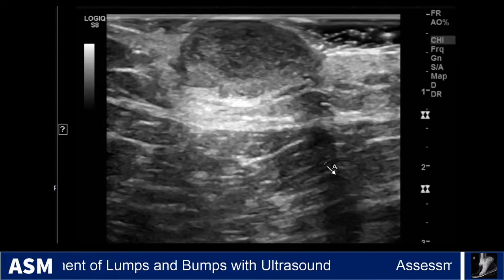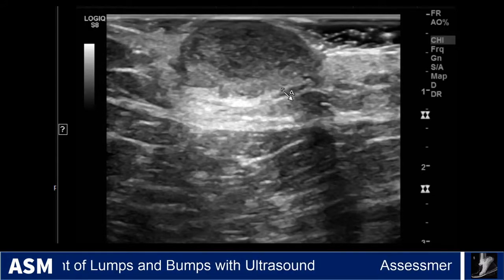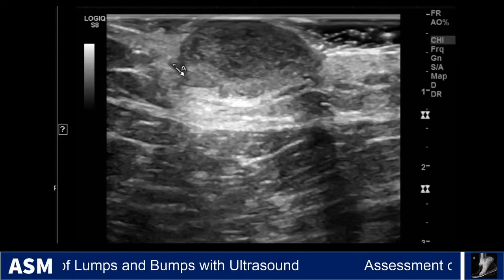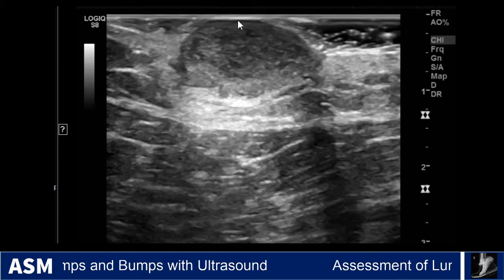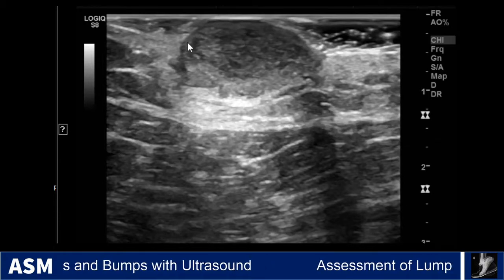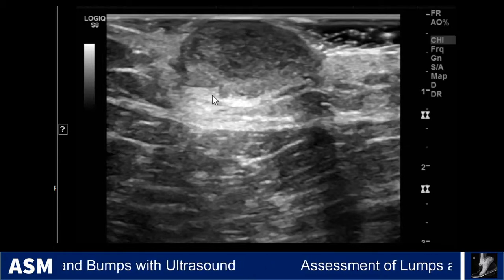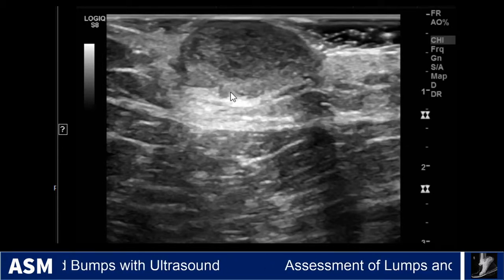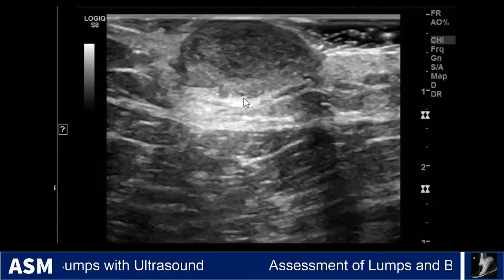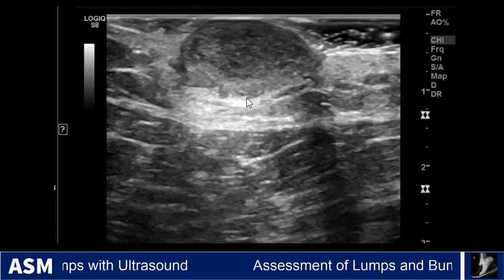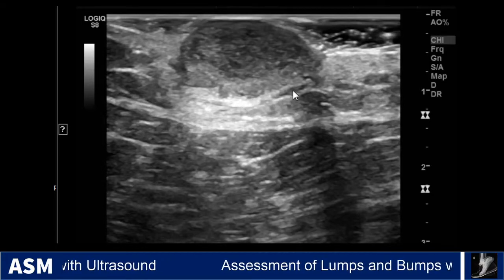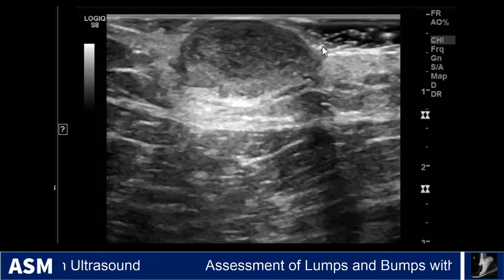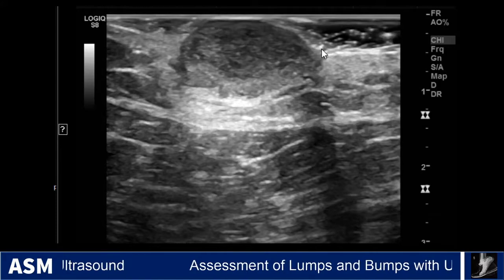Case 2 is another superficial thigh mass. We see a superficial soft tissue mass, somewhat circumscribed but with irregular borders on the deep margin. It comes right up to the skin surface.